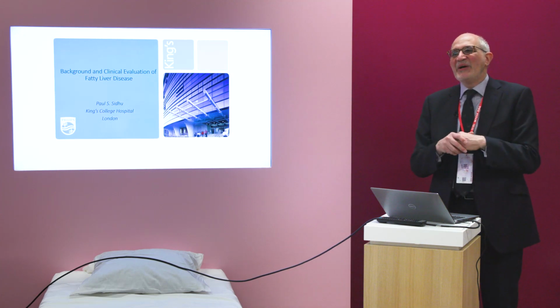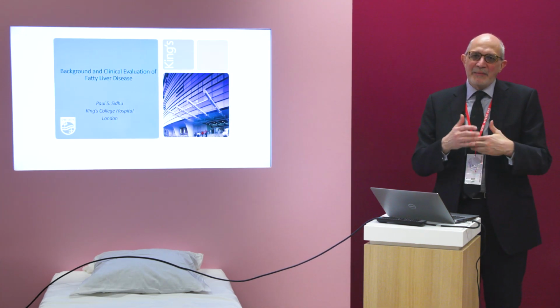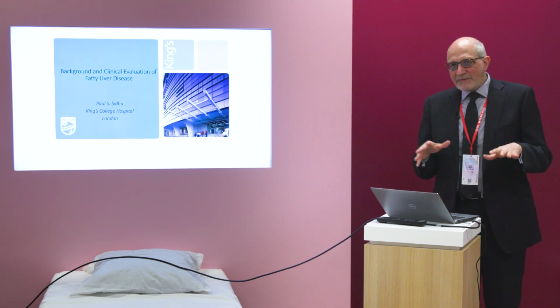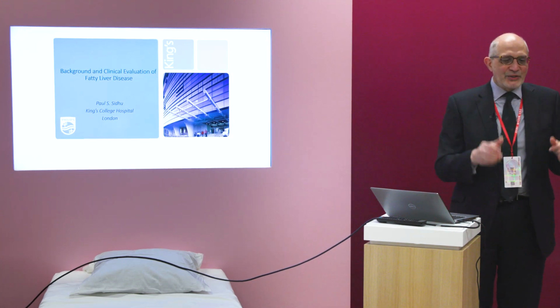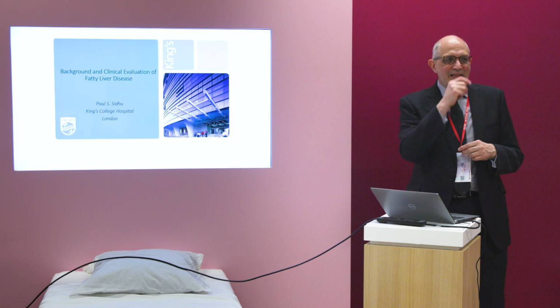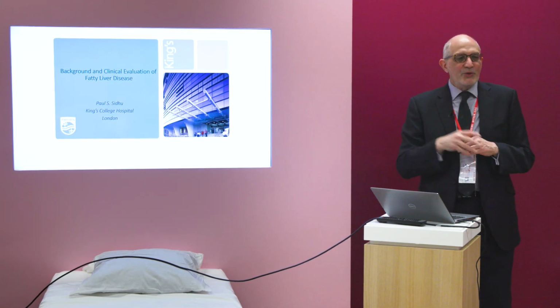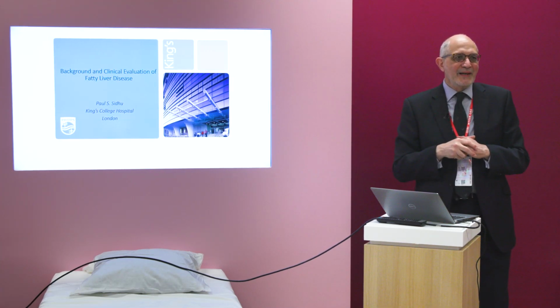We're here now, with a lot of changes having happened over a period of time, and we're going to quantify fat. Quantifying fat is, of course, important. If a patient comes to you and you say, this is mild, or very severe, you go off, you do your exercise, stop eating, and come back and I'll tell you whether it's better.